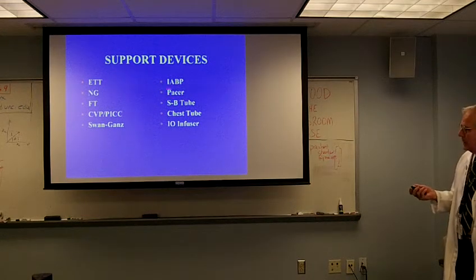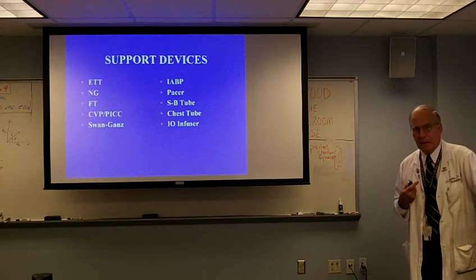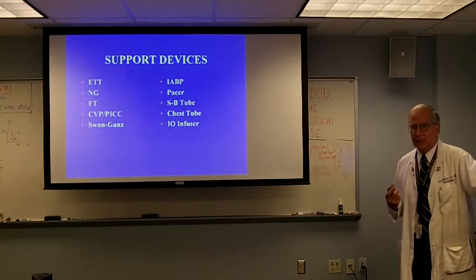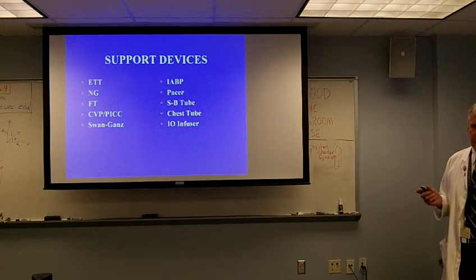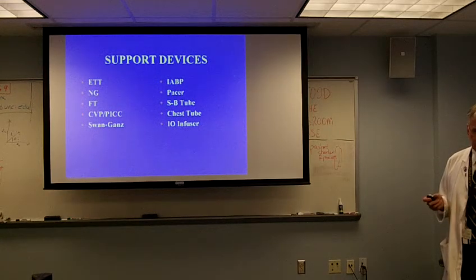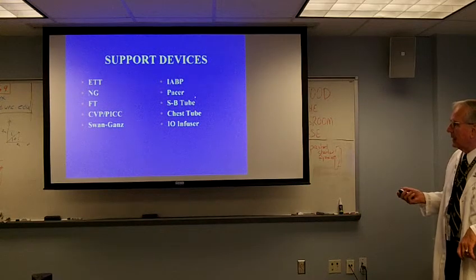I put pacers in just for completeness' sake, remembering who I'm talking to. Most of the time it's going to be medical students and house staff. But practically speaking, the electrophysiology fellow or the cardiologist is going to do all the determinations on that, and then they'll get a film to document position so they can see whether or not it migrates. That's generally not a problem you'll have to deal with.